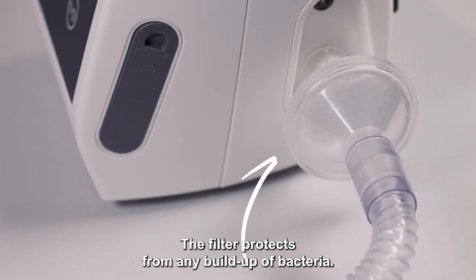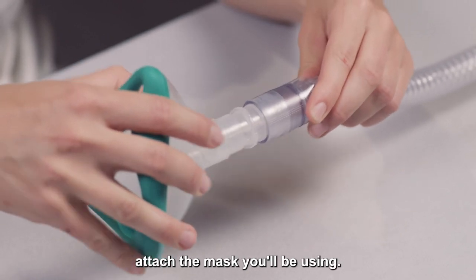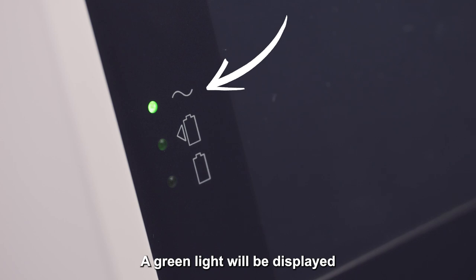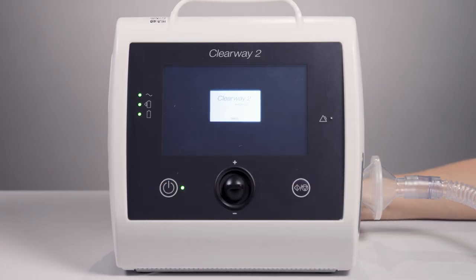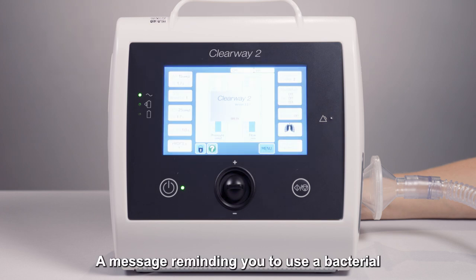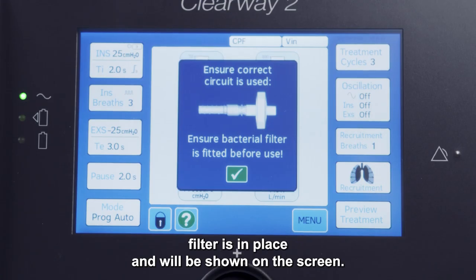The filter protects from any build-up of bacteria. At the other end, attach the mask you will be using. A green light will be displayed indicating that the device is connected to AC power. Press the power button to turn the device on. The Clearway 2 will be in standby mode. A message reminding you to use a bacterial filter will be shown on the screen.